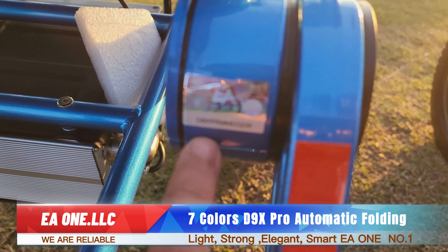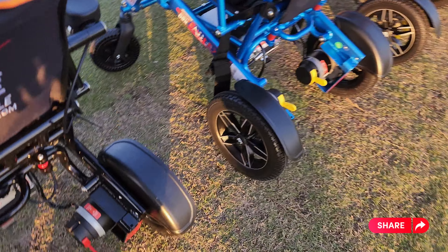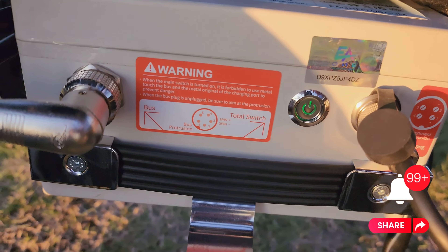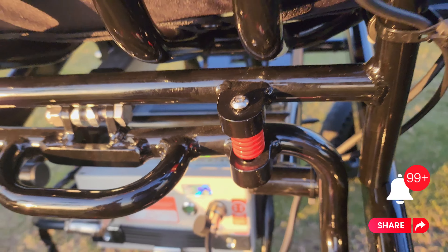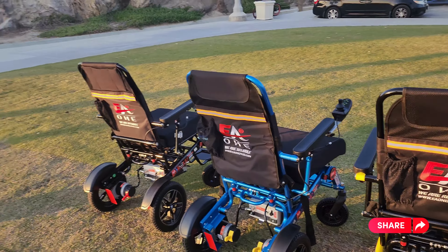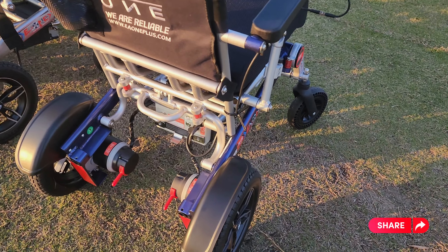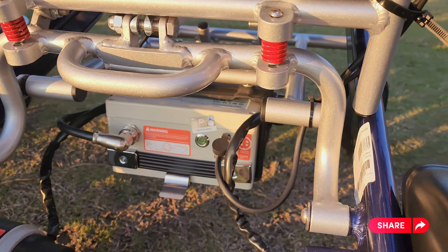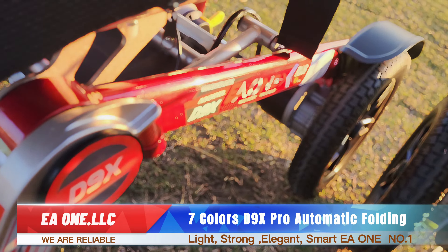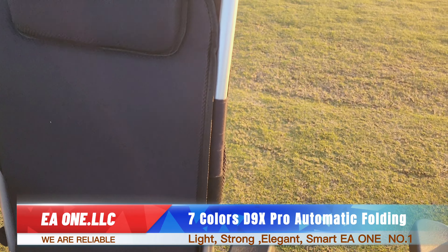We also advise you not to buy any third-party wheelchairs. You can verify this is our wheelchair from the watermark EA1 sticker right here — it proves this is the original. Third parties will make false claims such as 450 pounds of weight, which is all lies. We also have the sticker on our battery and motors. The motor is very exclusive, very powerful, and set exactly to the battery measurements so the battery does not explode.